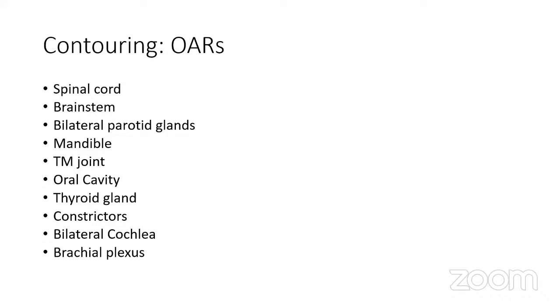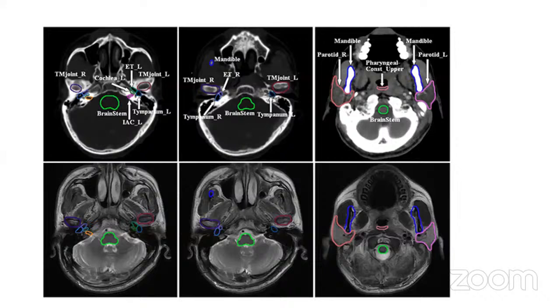Thyroid gland, yes, post-radiotherapy hypothyroidism is important. We try and minimize the dose if we can. I don't think constrictors are routinely spared for laryngeal cancers as far as we do in our practice. And of course, you've got cochlea and brachial plexus as well.